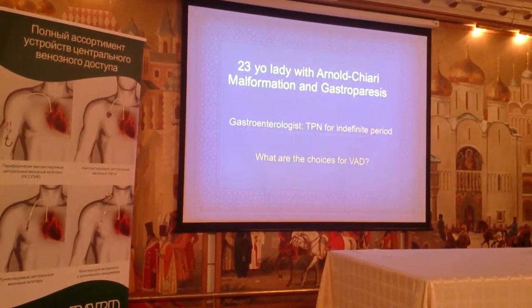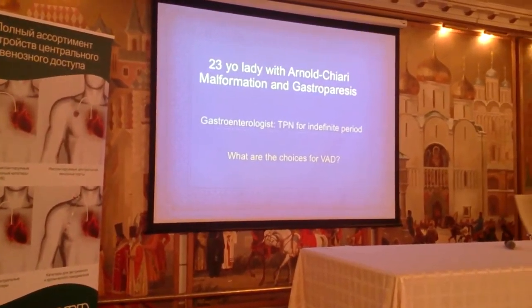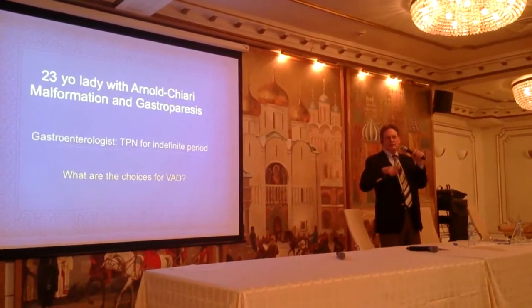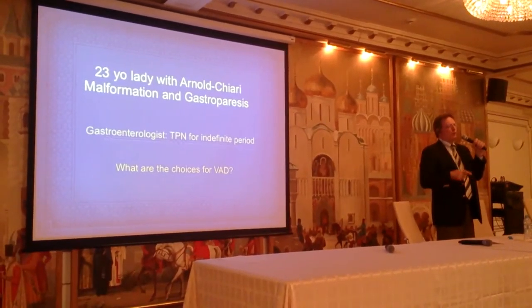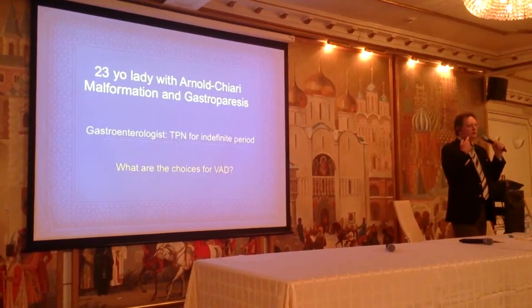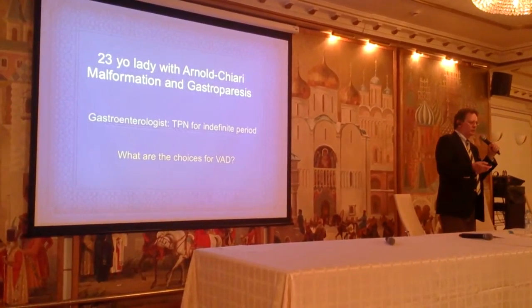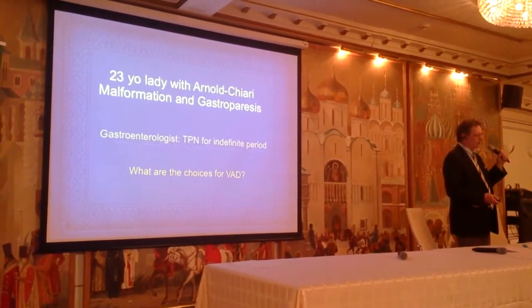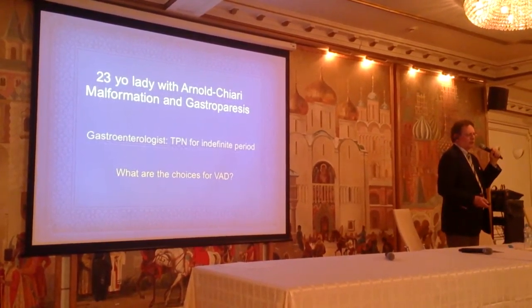I don't like ports for continuous therapy. I like ports more for intermittent therapy, like chemotherapy. So the choice here would be a PICC or a tunnel catheter, IJ tunnel on the chest. I spoke with the patient and she preferred the tunnel catheter, so I'm going to demonstrate a right internal jugular tunnel catheter.